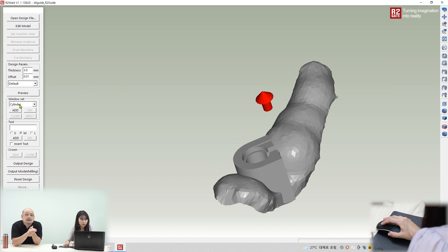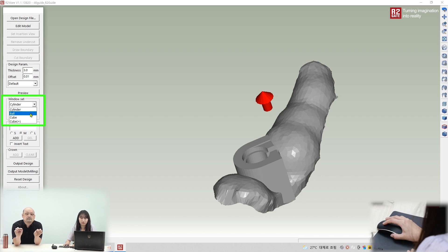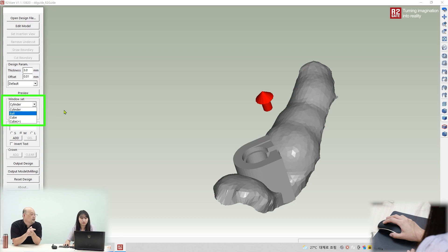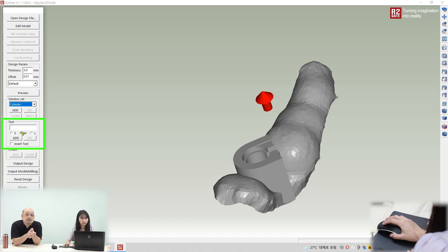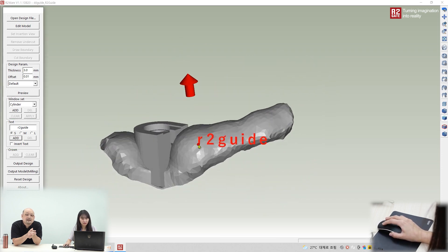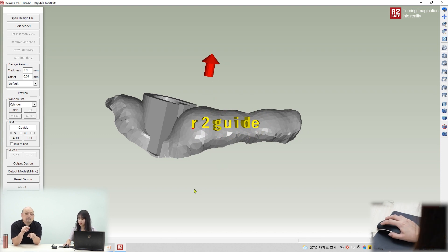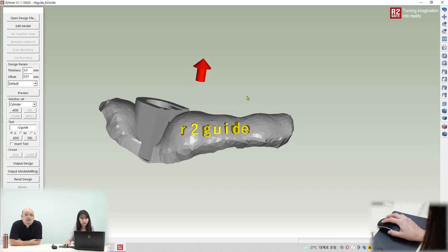There are other options — you can add a bar, ball, or other structures. This is a half arch guide. If you want to make a full arch, you need to add some internal structures to make it more stable. We'll show that in a bigger case next time. You can also add the patient name as text — just left-click to place it on the guide.